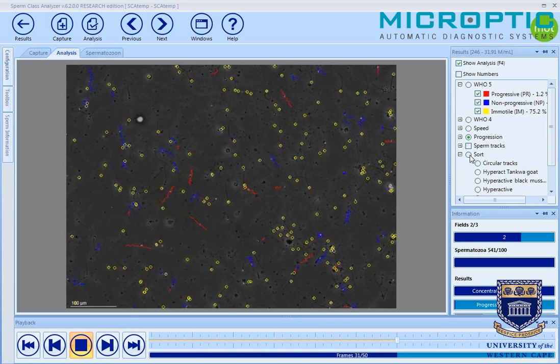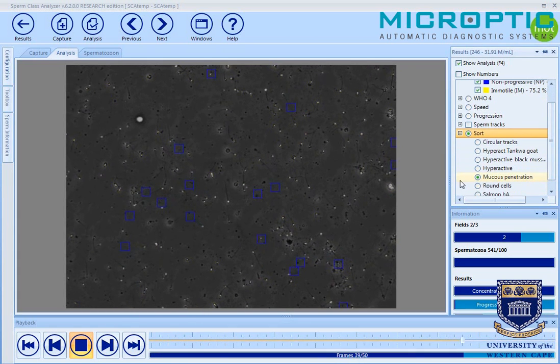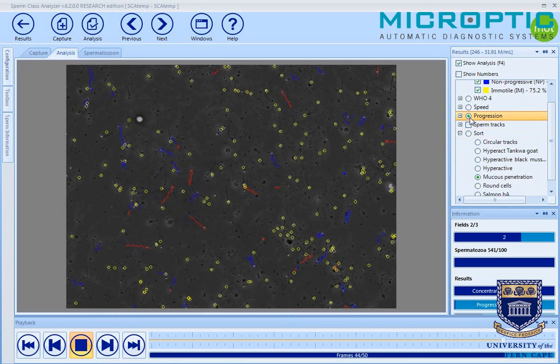We can also look at those sperm that have actually passed the mucus penetration test — these will be shown with blue squares. One can see that the sperm swimming through these squares are indeed the very progressive ones. Setting it to progression, it clearly represents almost all the red sperm. These sperm all meet the same criteria: an average path velocity of more than 25 micrometers per second, a straightness of 80%, and an ALH more than 2.5 and less than 7.5.